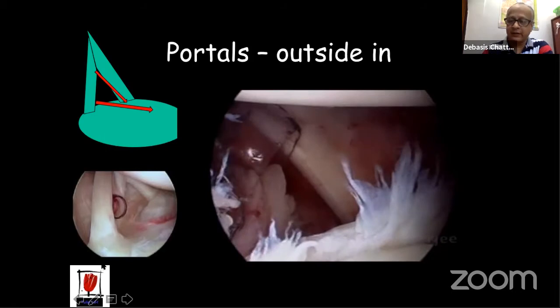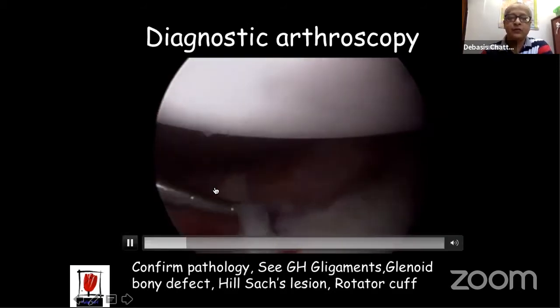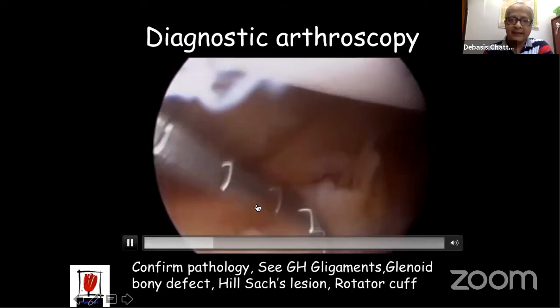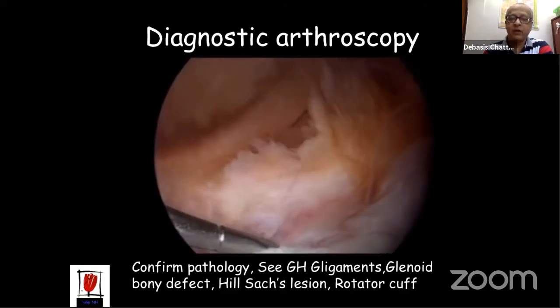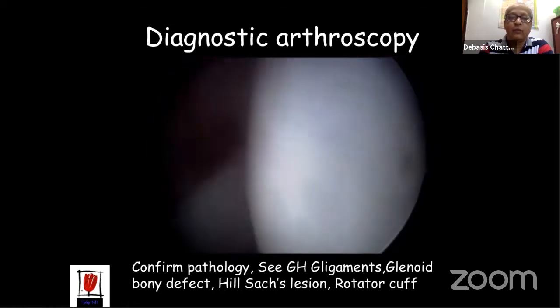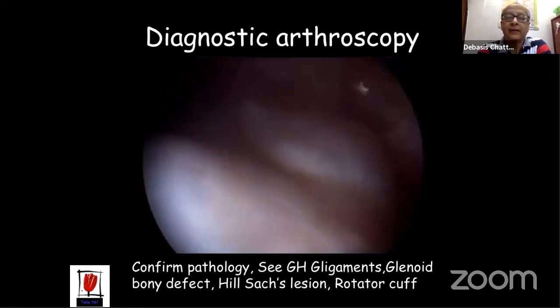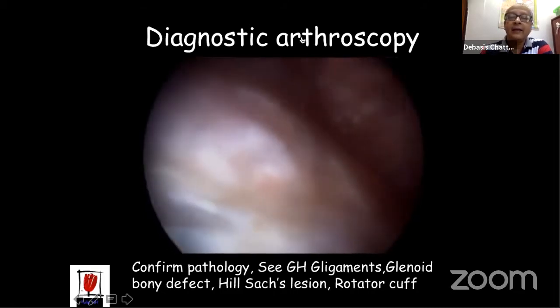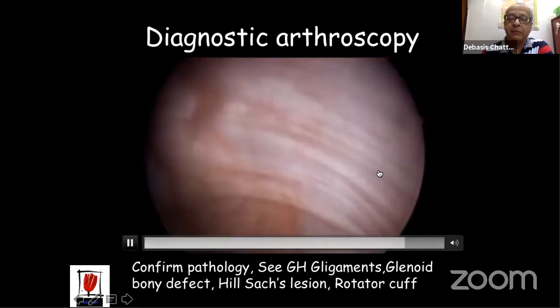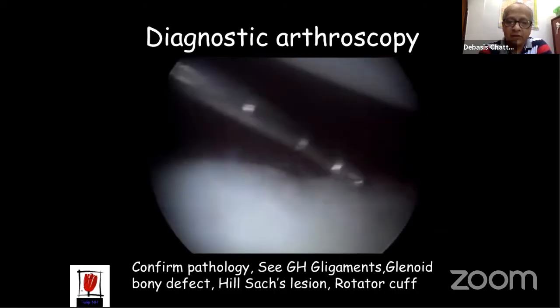Once you have done these two things, you are ready to have a look inside, the diagnostic arthroscopy. The idea is to look at the anterior labrum, its laxity and detachment from the glenoid margin, also the glenohumeral ligaments, then any glenoid bone defect, and then you also see the rotator cuff tendon. As you can see here, you look at the Hill-Sachs lesion, and then finally you come to the axillary pouch to look at the axillary pouch also, and that completes your general diagnostic arthroscopy. At the end of this, you decide on the planning of the treatment for this patient.